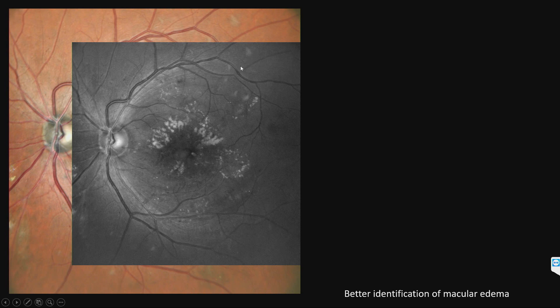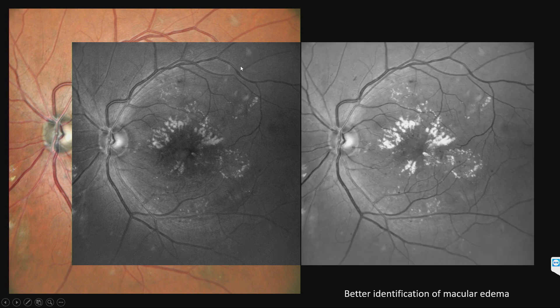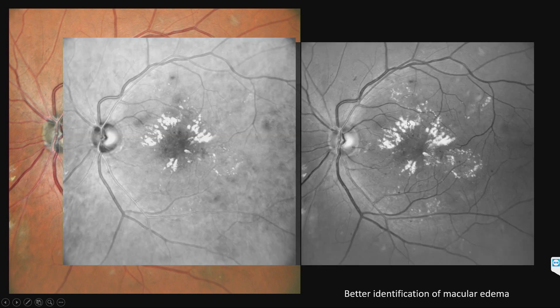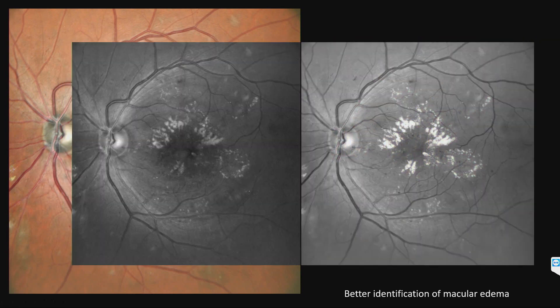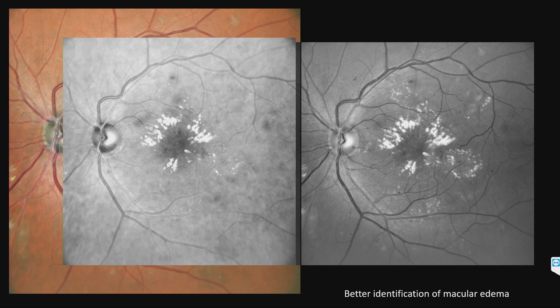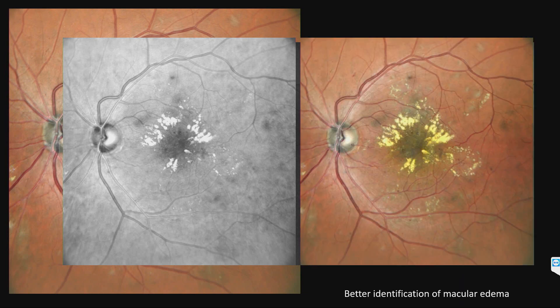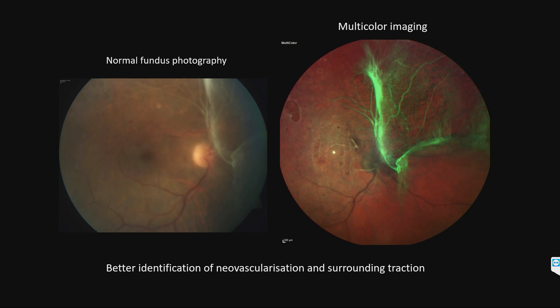The blue reflectance image shows areas of cotton wool spots very clearly. The hard exudates are seen with much more precision. Microaneurysms and hemorrhages are more clearly seen in the green reflectance image. The red reflectance imaging shows retinal pigment epithelial and choroidal details. In proliferative diabetic retinopathy, multicolor imaging gives better identification of new vascularization and surrounding traction.